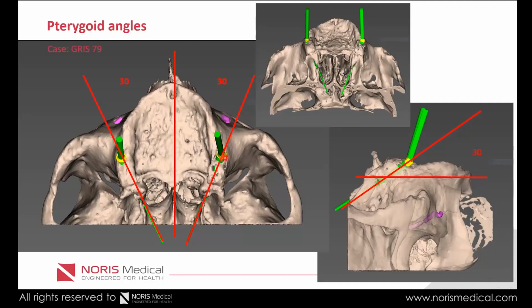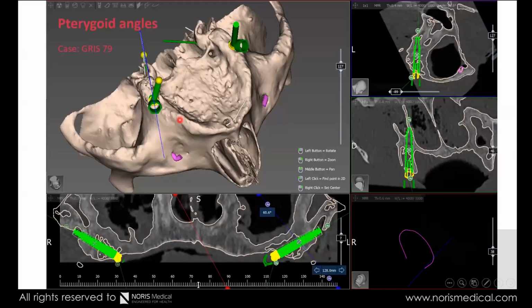Now, the implant is leaning something like 30, 45 degrees. It depends, but this is the rule of thumb. That's where we're starting to look. One way of giving us a clue is the hamulus, because with the finger we can locate the hamulus, and the plane that we want to work through crosses from the entering point through the hamulus toward the medial plate. This is the plane where the implant is going to be positioned.